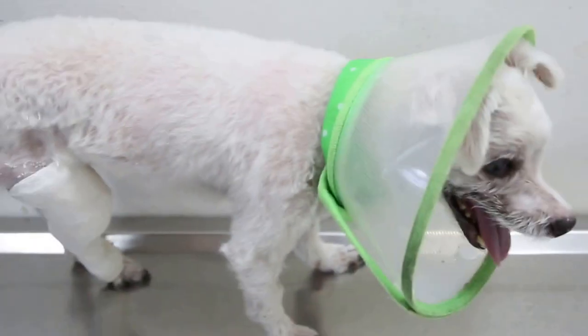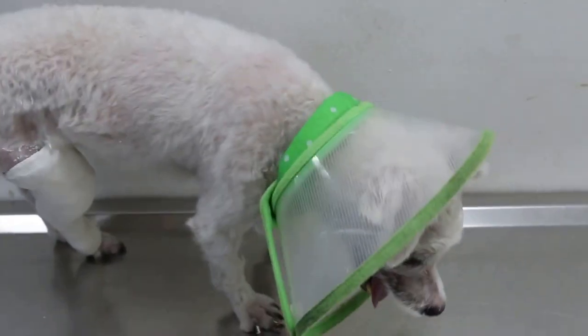Also, if it's swollen, then I have to cut about 1 cm here. Cut 1 cm — is it swollen or not before it goes home? No. And this is a dog which jumped down from the sofa.